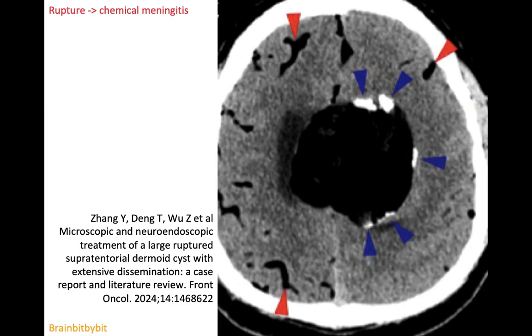These are CT images at another level where you can again see the fatty substance in the subarachnoid space. And if there is rupture into the ventricles, it typically presents as a fatty level floating on top of the CSF.